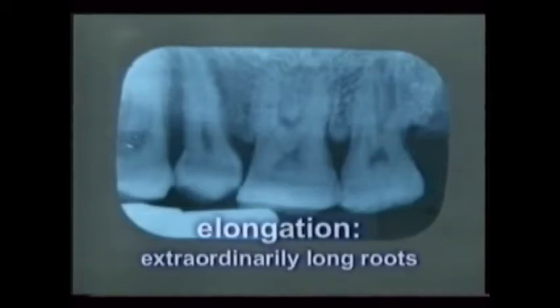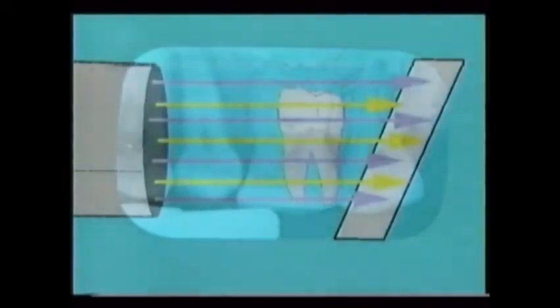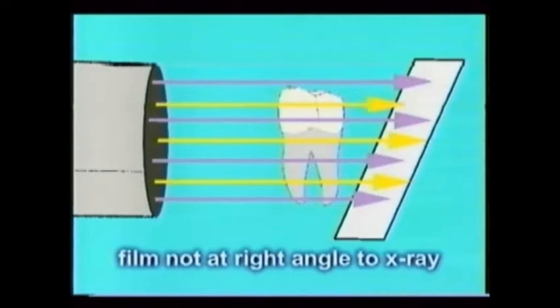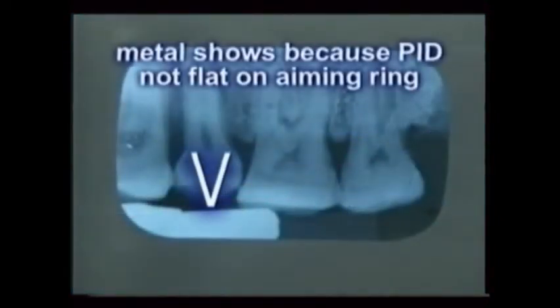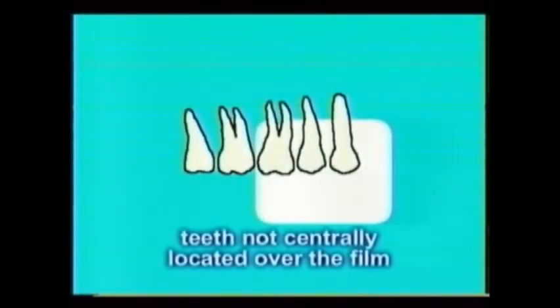Certain film placement errors may be seen in the processed films as well. Extraordinarily long roots, called elongation, often leave the edges of the film, as seen on this premolar. Here, the x-ray beam glanced off the film at other than a 90-degree angle because the film was not at a right angle to the beam. The metal part of the film holder also comes into view, seen in white. If the roots seem to leave the film yet are not seemingly stretched out or elongated, the film was not placed centrally over the teeth to be examined.